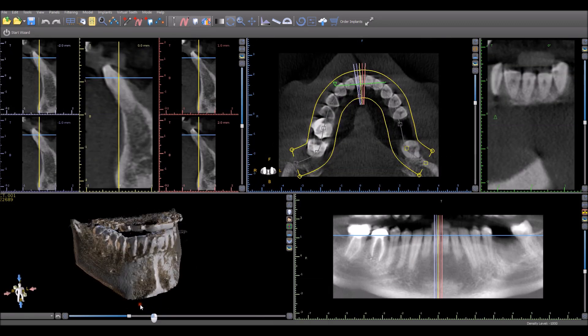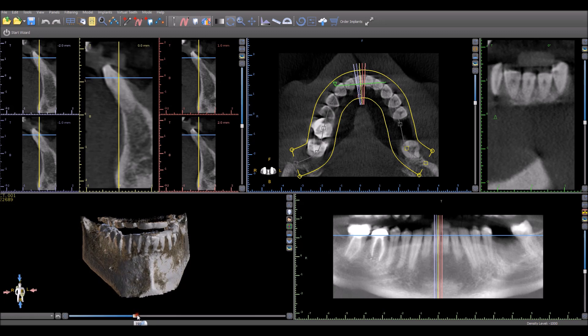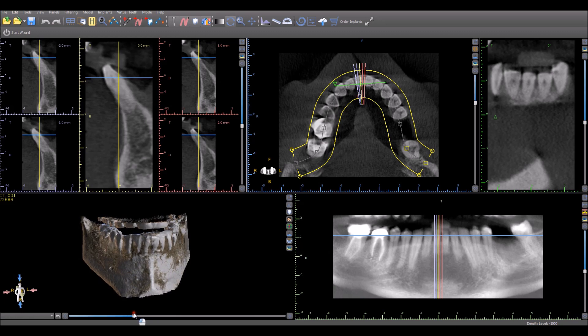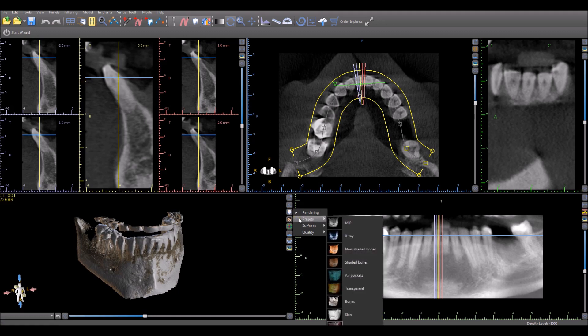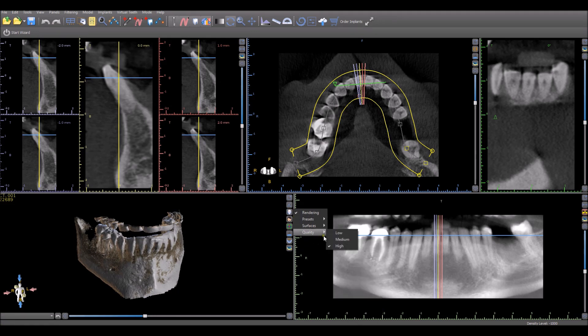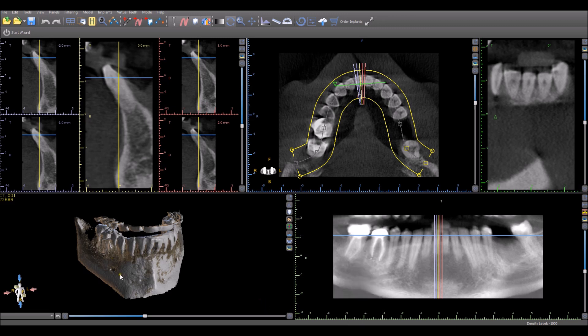The premium plan is loaded. The slider at the bottom of the 3D view can be used to change the density threshold. The different renderings can be changed by going to Presets. Usually Surfaces is the best one to be working with.